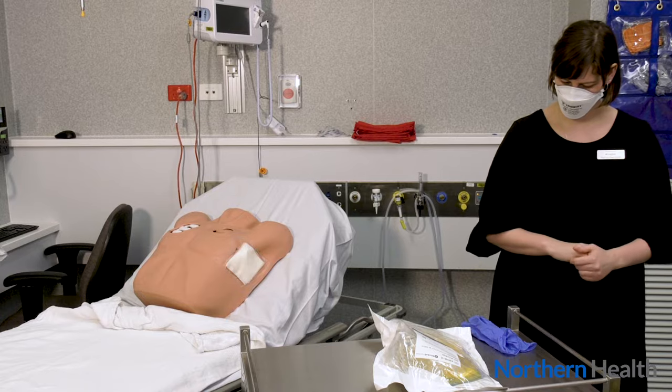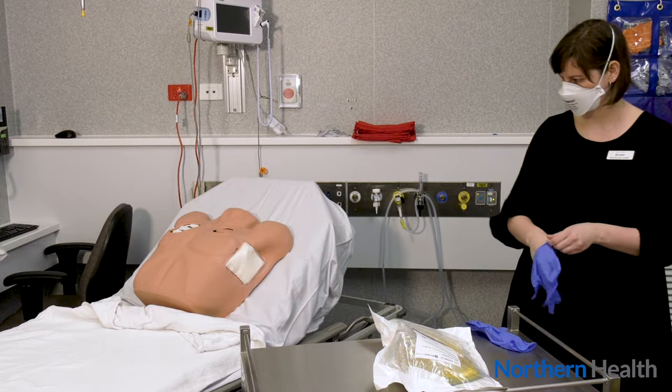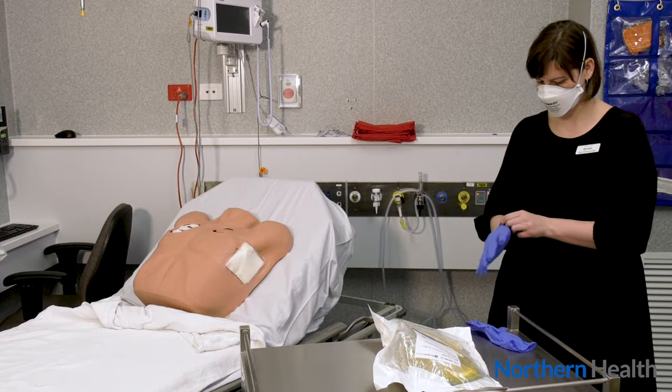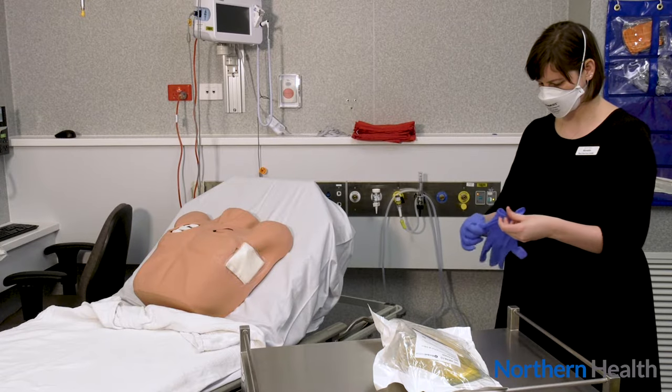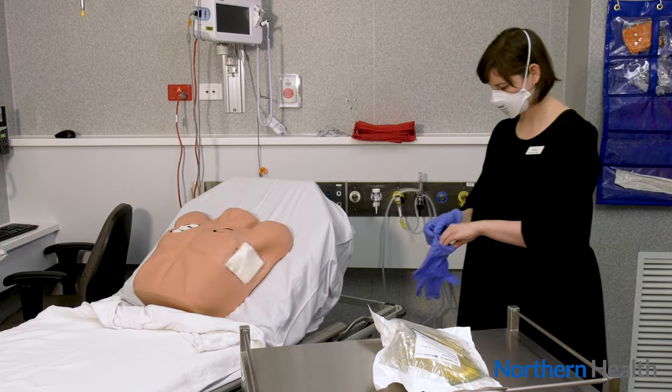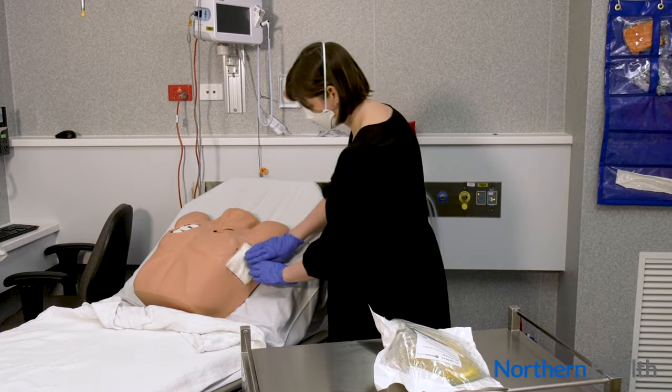To begin the drainage procedure, collect all the equipment, ensure the table you are going to use is clean, and the individual is in a comfortable position. Now clean your hands by washing them with soap and warm water. Remove any rings or jewelry that may get in the way or that might puncture the gloves or the tube.